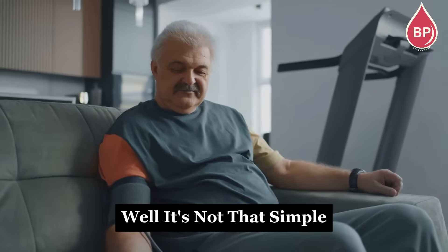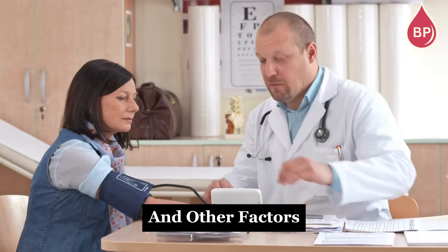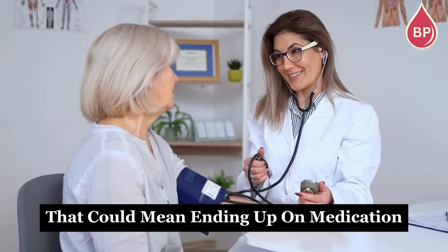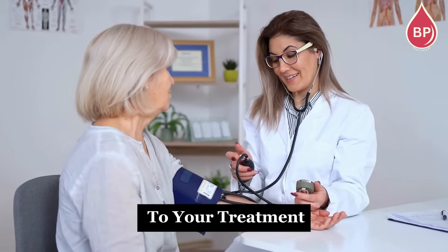Well, it's not that simple. Neither is entirely correct. How you prepare for the test, the position of your arm, and other factors can impact your blood pressure reading by 10% or more. That could mean ending up on medication you don't actually need, or your doctor making the wrong adjustments to your treatment.